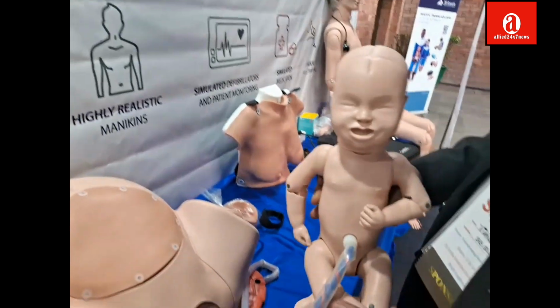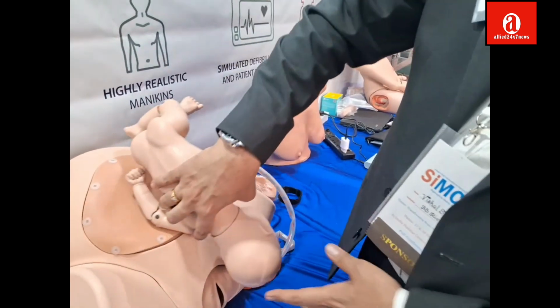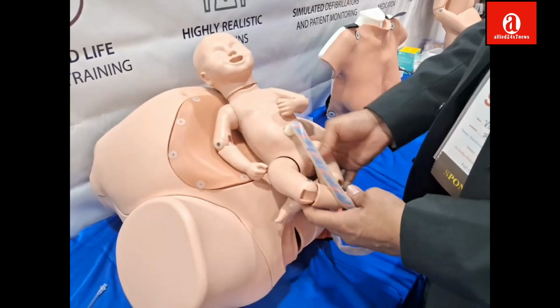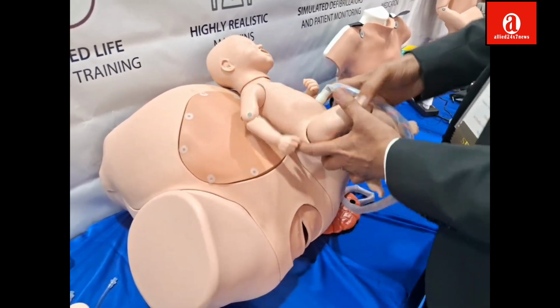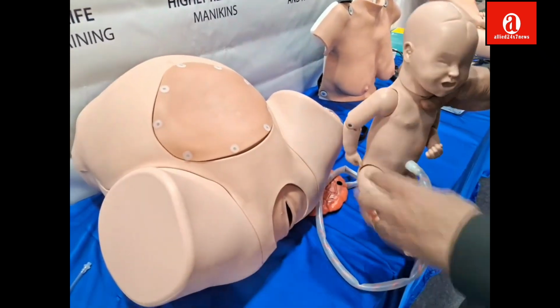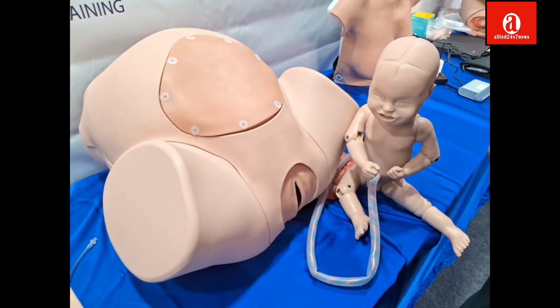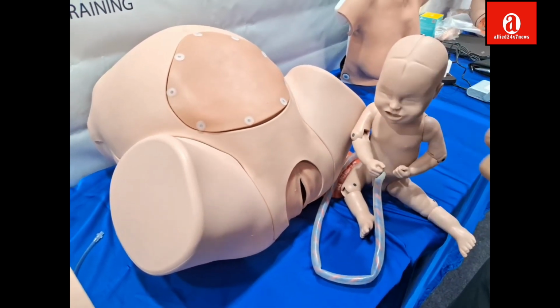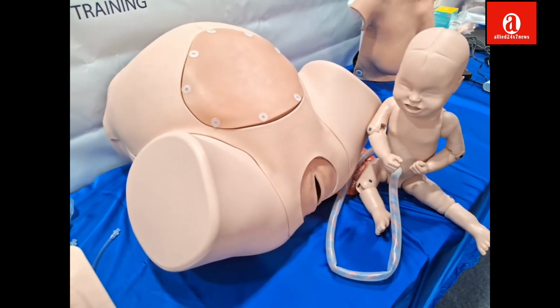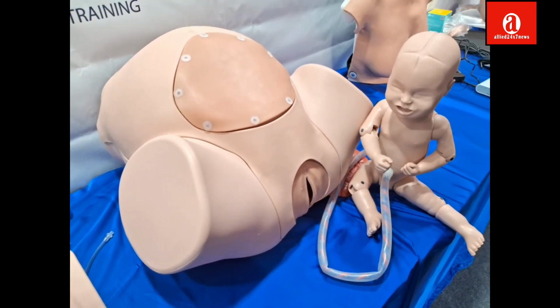Now, normal delivery. Then there are breech deliveries, when usually the baby is positioned like this inside, but sometimes the baby is positioned like this. Their legs are out, sometimes the hips are out. These are different complications of birthing. Sometimes the mother cannot push the baby outside, she's tired and has some loss of consciousness, maybe becomes unconscious eventually. So the baby is stuck. Nobody is going to push it, all muscles are relaxed. So we can do instrumental deliveries with the help of suction.